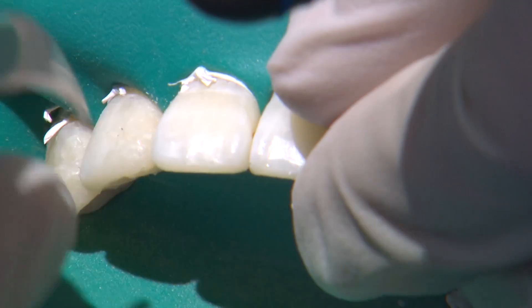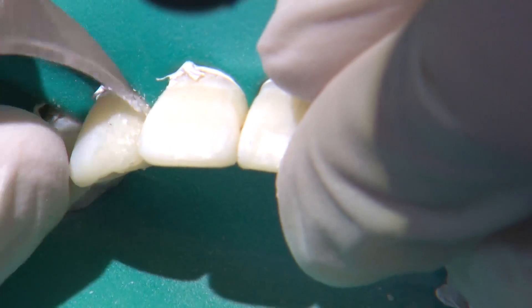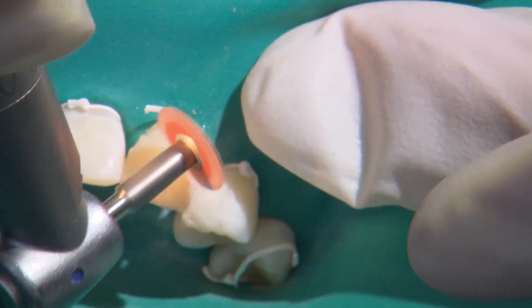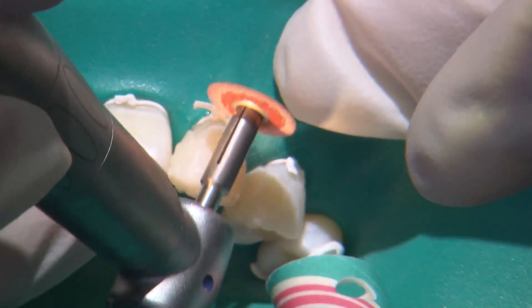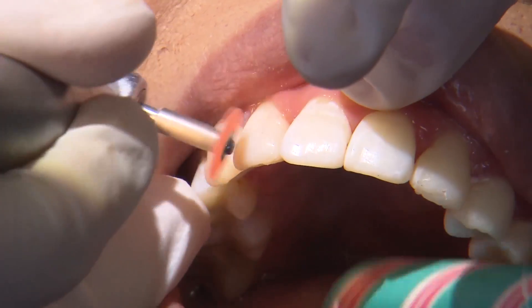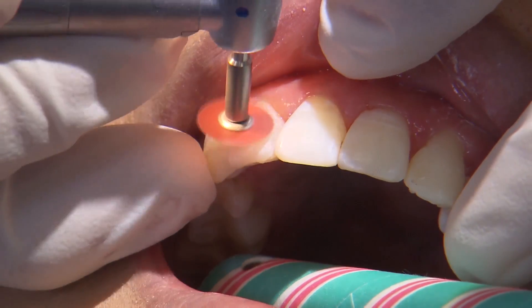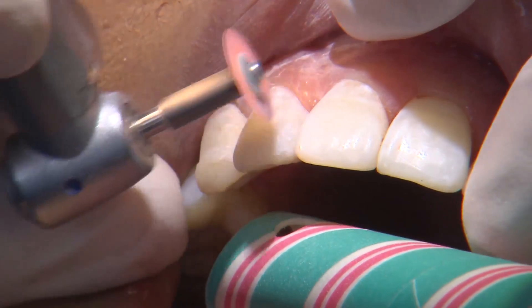A 12 blade is very useful to remove any roughness along the transition between the natural tooth and the resin application. Any overhangs or roughness can lead to gingival inflammation, so in order for this to be a healthy addition to this patient's dentition we need to try to ensure that the margins are indiscernible. The darker colors of the soft flex discs are used primarily for gross reduction, the lighter ones for refining the contours and margins and removing any large areas of surface roughness, and the lightest colors allow you to polish the restorations to a high shine.